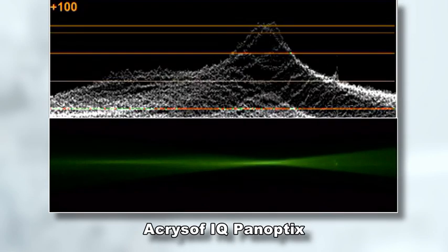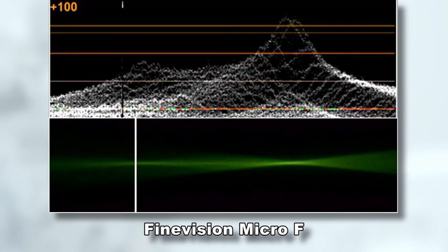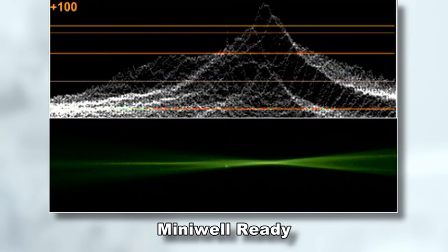Here we see the analysis of the AcrySof IQ PanOptix. We can see here a predominant distance focus, a smaller focus for the near and a very close intermediate focus. The FineVision shows a similar image like the PanOptix. In the Mini WELL Ready, we can see a good focus for the distance and a small plateau, which we call the EDOF area.